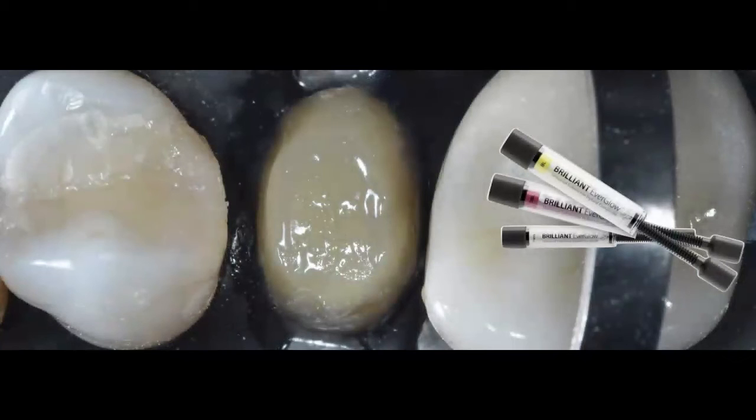And my next step is going to be to build that core. And I'm going to build this core with subsequent horizontal layers. These layers, I don't want them to be more than 1 millimeter thick. Again, I'm trying to decrease the C factor on that hybrid layer. If you were to look at geometrical figures, if you have a bowl, the bowl is going to give you the greatest C factor because you have a lot more walls.